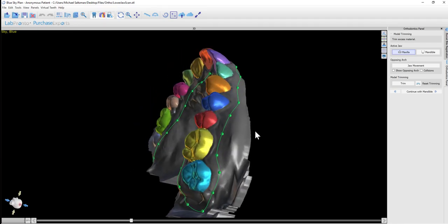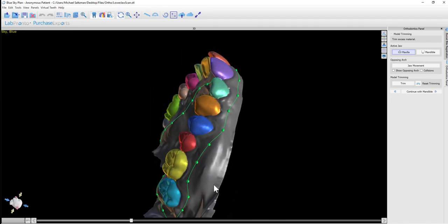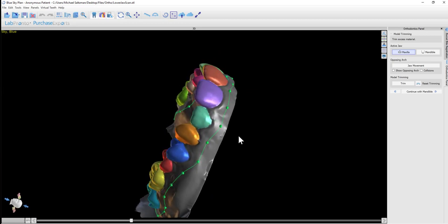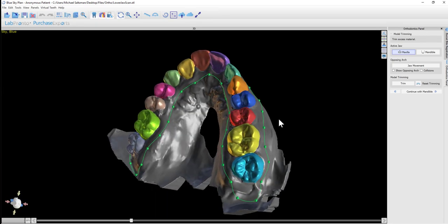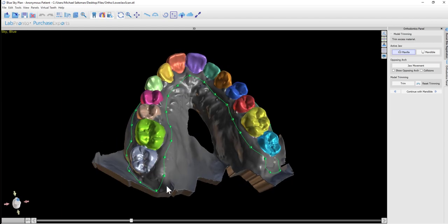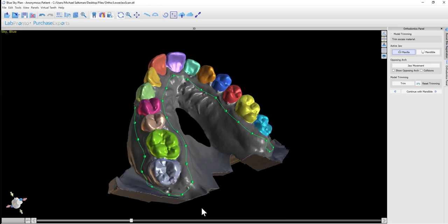The software places a dot 3mm below each tooth and connects the dots to create the trim line. We can review it, and if we want to make modifications, we can use the left mouse button to grab and drag any of the points.